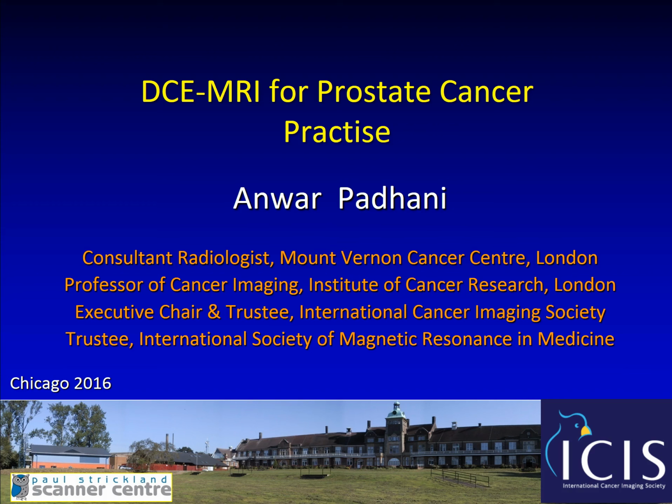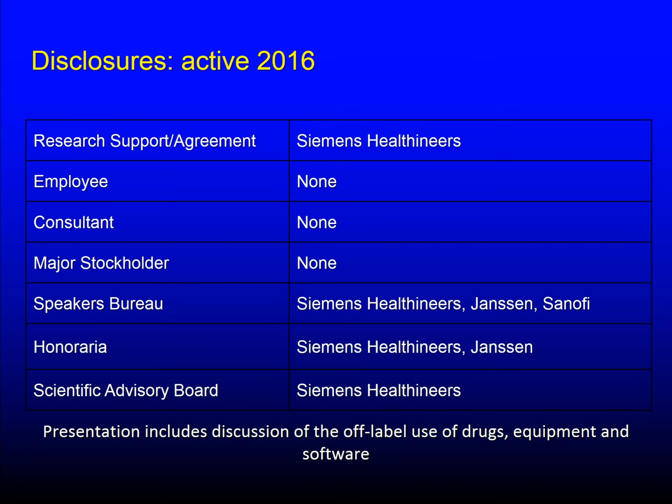My topic is going to be to illustrate the role of dynamic contrast enhancement for prostate cancer diagnosis in practice. These are my disclosures.